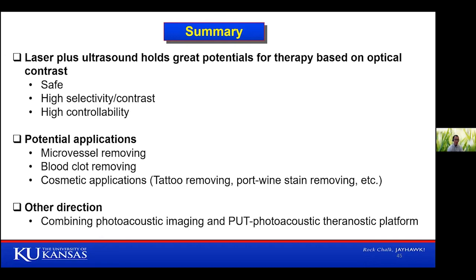Then we have some potential applications: microvessel removal, which I showed you, and blood clot removal. We also work on a number of other things, like tattoo removal and port-wine stain removal. Those are cosmetic applications. In other directions, this technology can naturally be combined with photoacoustic imaging, because we use exactly the same laser as photoacoustic imaging. So naturally, it can become a theranostic system. Of course, we need to work out the therapeutic side first, and then we talk about the combining. But those are the future directions.